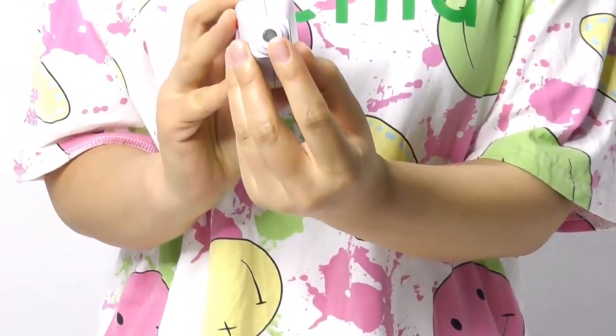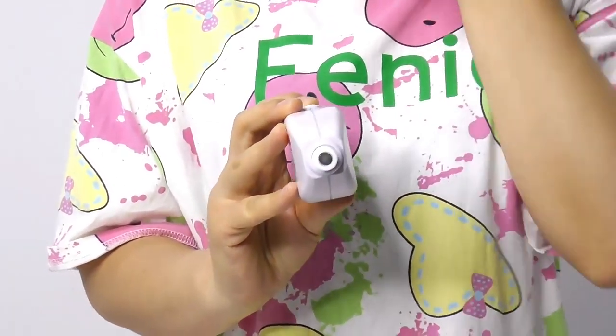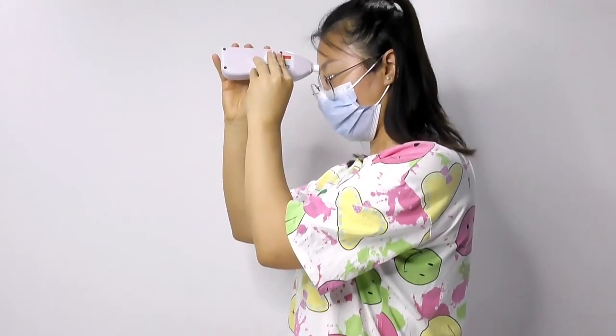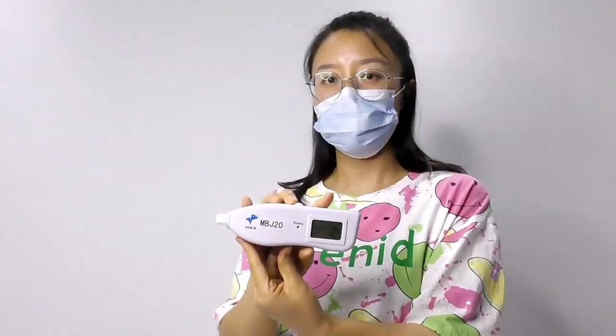Press the probe on the newborn baby's forehead or sternum. Press vertically, and the device will then display the measured value.